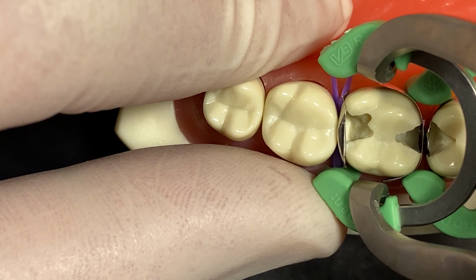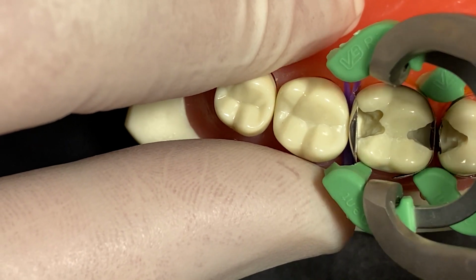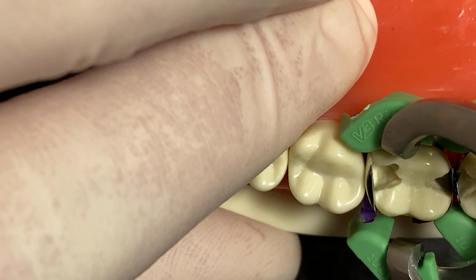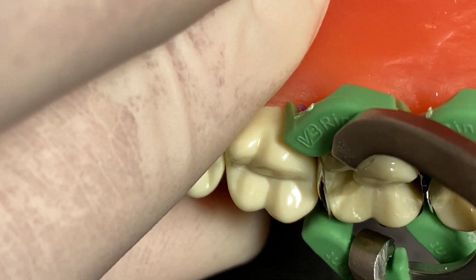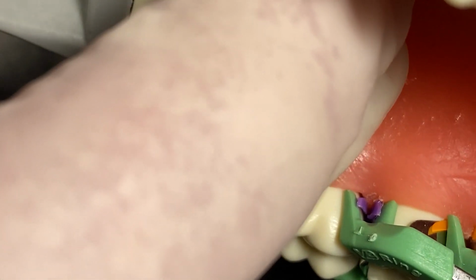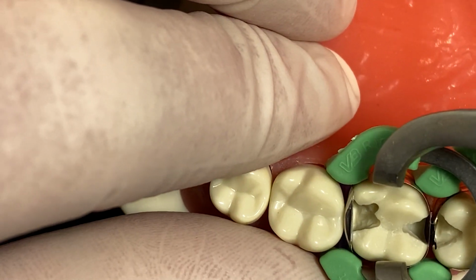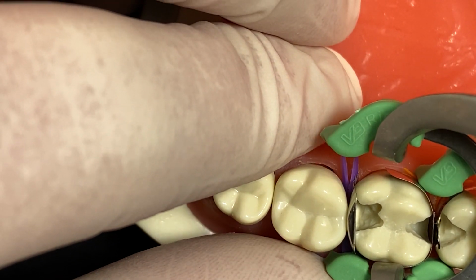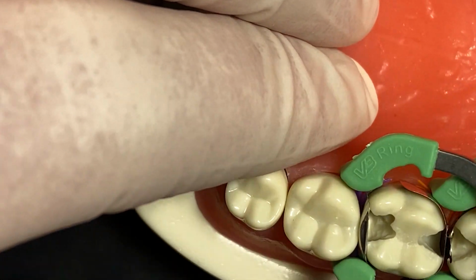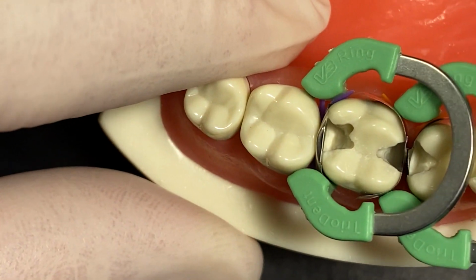If your wedge is really straight and you're not wanting to mess with the setup, then simply treat this like a normal wedge and just pop the ring over the top and allow the split wings to come through the middle. I do that sometimes. It kind of depends on the case, but more times than not, I grab at least the side attached to the matrix and let the ring really pull that against the tooth and really give me a good gingival seal.